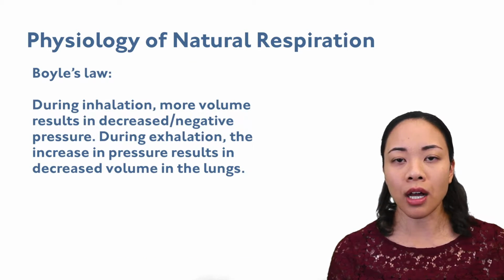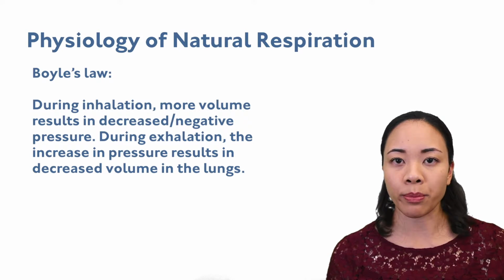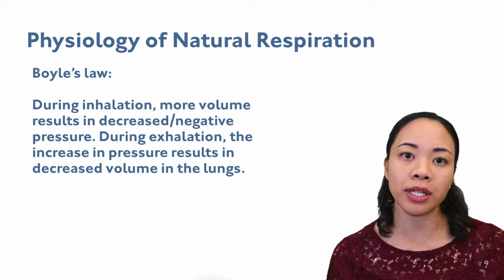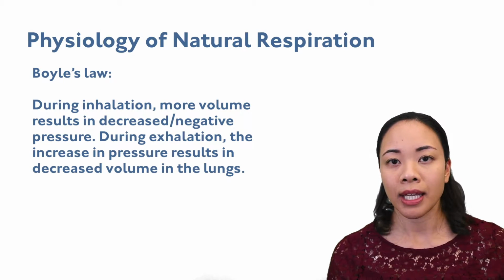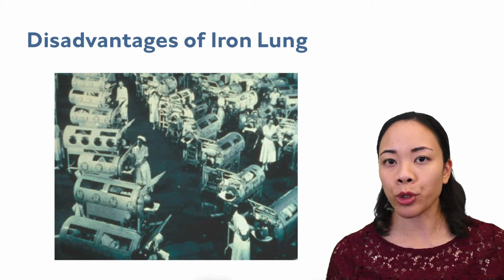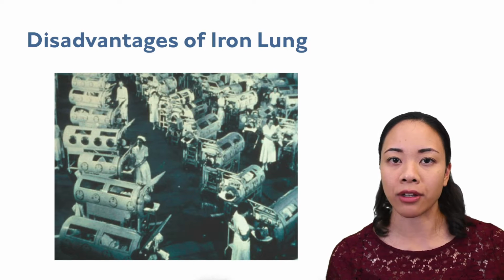According to Boyle's law, during inhalation, more volume results in decreased negative pressure. During exhalation, the increase in pressure results in decreased volume in the lungs. As useful as negative pressure ventilation was in the past during the polio epidemic to save countless lives, there were disadvantages to the iron lung.